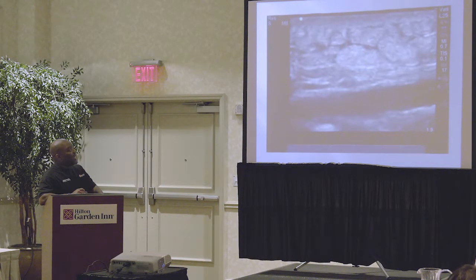Remember I talked about the indicator of the patient? That's what I'm talking about, that little green dot there. So if this were a chest wall, for example, then I would know that this is closer to the patient's head and this would be closer to the patient's feet, because the transducer has to be pointed towards the head or to the patient's right. Does that make sense?